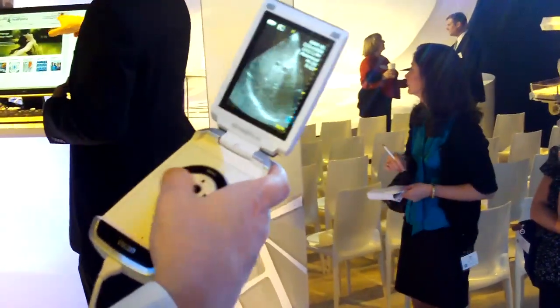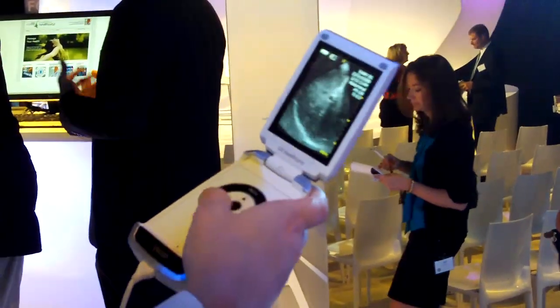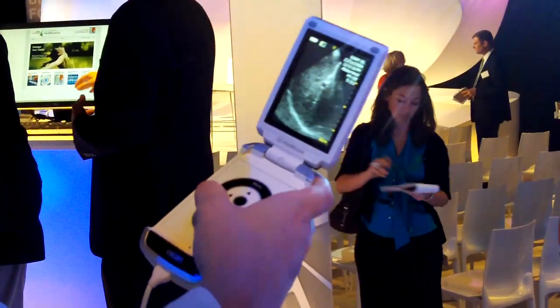It's thumb operated user interface. I can adjust the gain. We've got color doppler.